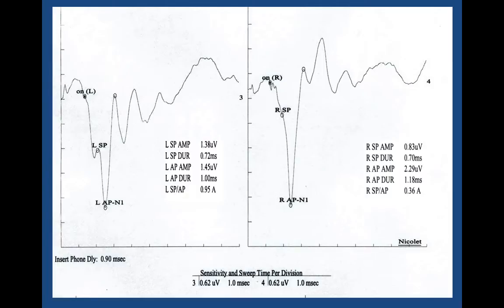For years, really almost 30 years now, the hallmark of a positive electrocochleogram for endolymphatic hydrops was the observance of an enlarged summating potential component, especially in comparison to the action potential component, what we now refer to as the SP-AP amplitude ratio. If that was enlarged, then this electrocochleogram would be considered positive for endolymphatic hydrops, especially in comparison to this patient's other ear, which shows a normal ratio. And we'll get eventually to what's normal and what isn't in a bit.